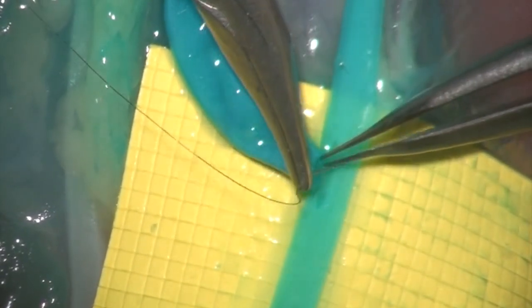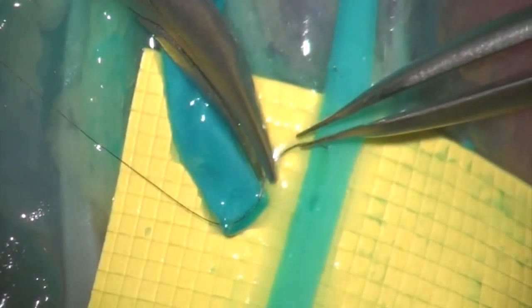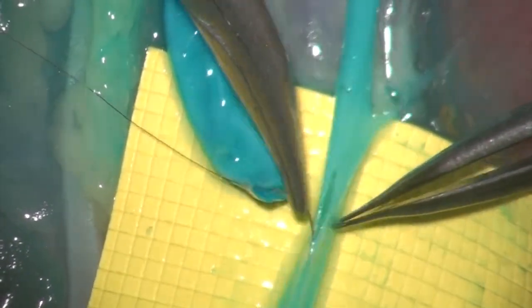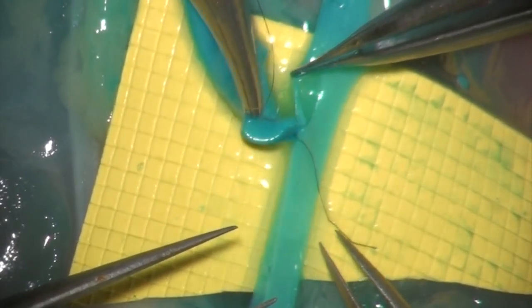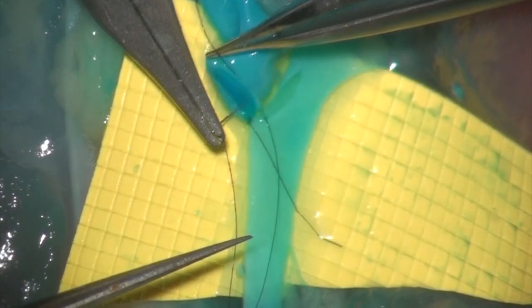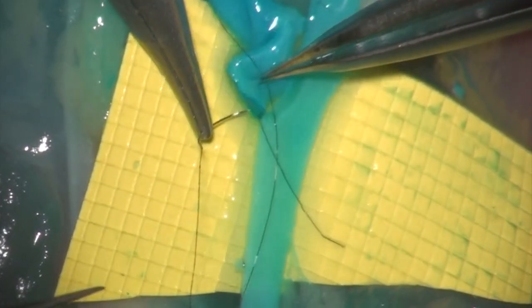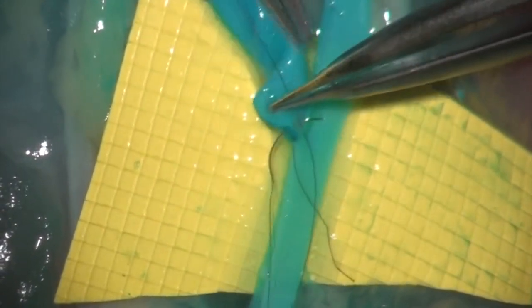The sequence of stitches is of the utmost importance when doing end-to-side microanastomoses. The first stitch is placed in the surgeon's forehand at the 180-degree position furthest from the surgeon. The next stitch is placed in the back wall, first in the recipient vessel, then in the donor vessel, both in the forehand. It is helpful to work top to bottom, left to right, like you are reading a book. This will prevent you from getting in the way of your subsequent sutures. It is important to travel the same distance between the donor and recipient vessel.